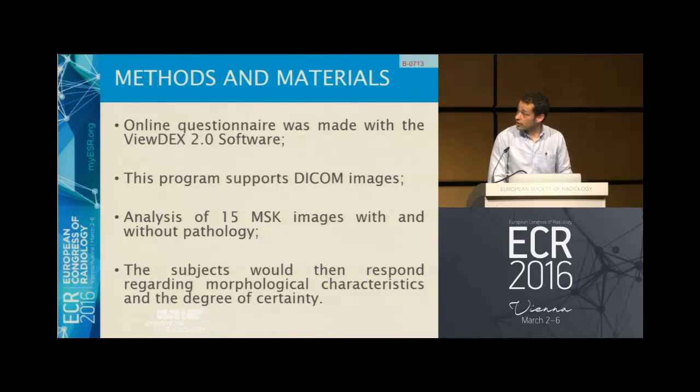Our online questionnaire was made using the ViewDEX software. This software allows us to use DICOM images and provides us immediate feedback. We chose 15 images with and without pathology, and subjects would then respond regarding morphological characteristics and the degree of certainty. They also were given a briefing about how the program worked to get acquainted with the interface.